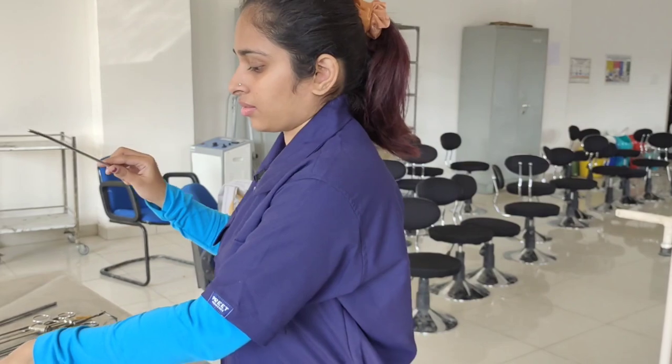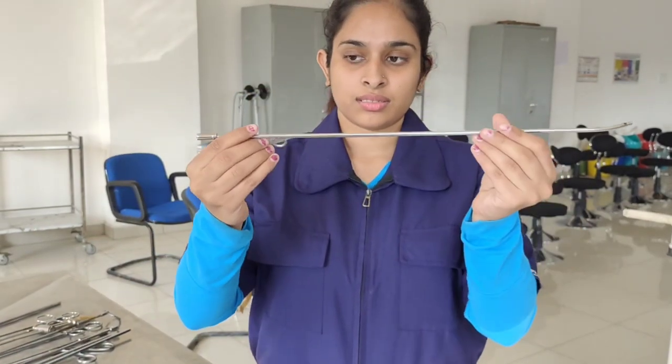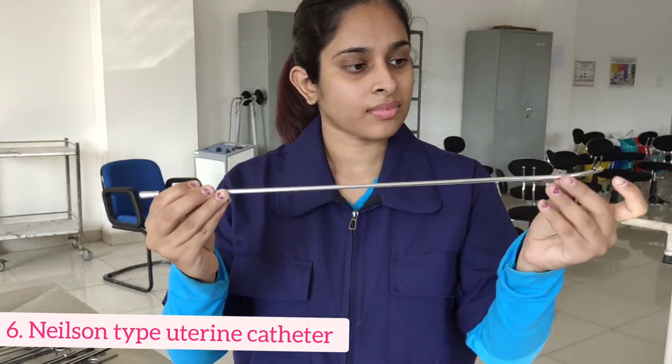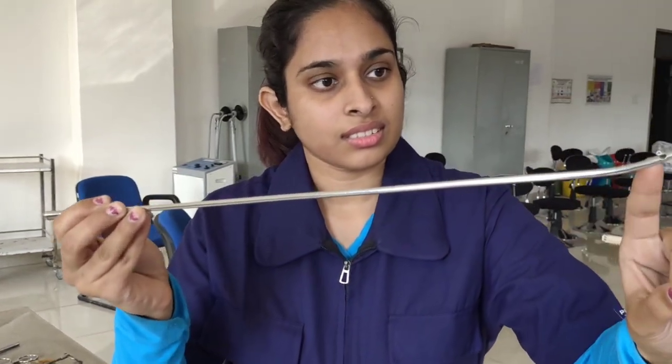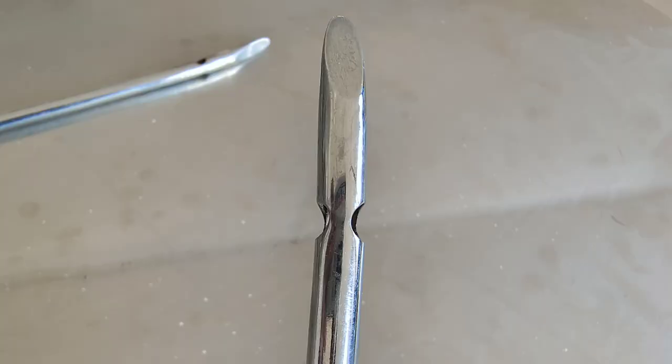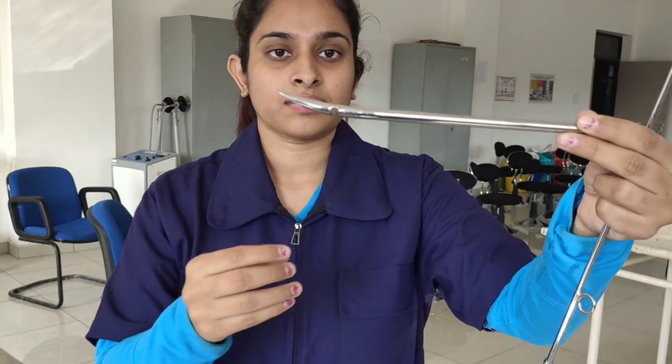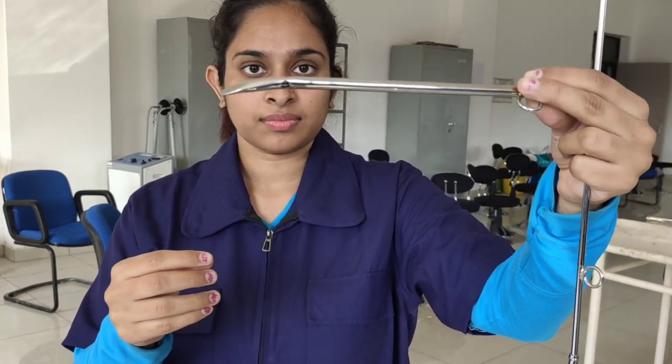Due to just one opening there's no way out and this may make the infusion difficult. To solve this problem we have a better version called the Nielsen type uterine catheter. If we closely observe its end, the opening here is given sideways in contrast to the previous catheter. There is also another variant with a curved end where you can manually plunge out the suction.